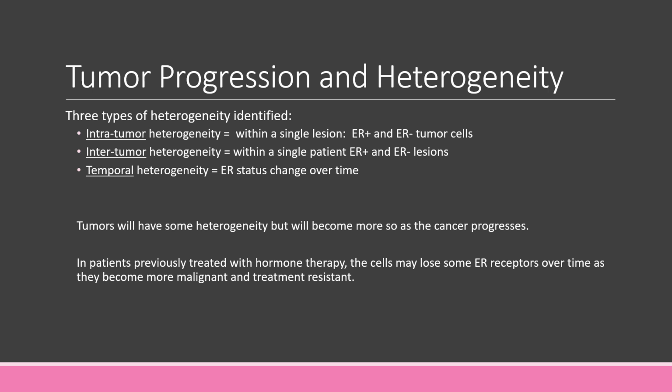Once a patient relapses, if they are ER negative, overall survival at that point is the same as somebody who's been negative all along. So very important to understand when an ER positive patient becomes negative so the proper therapeutic choice can be made. So this is one of the key areas where the F18 FES study, especially in conjunction with an FDG study, are extremely important to the patient.